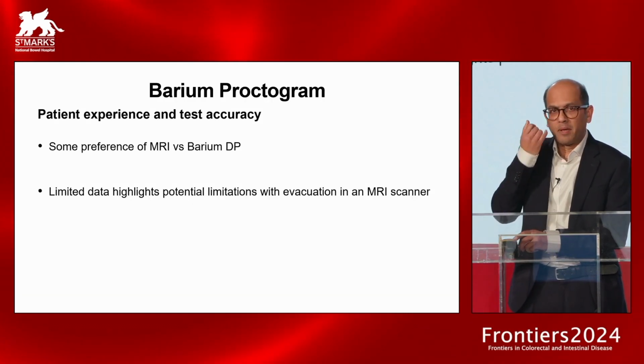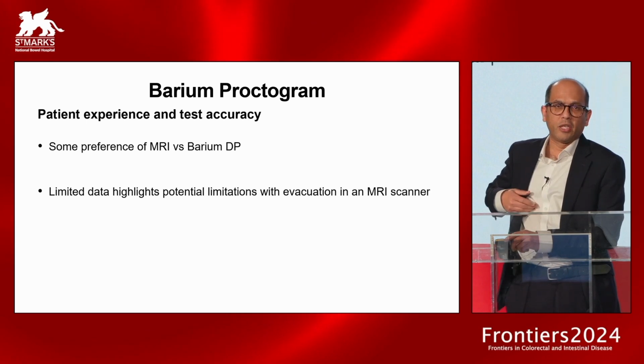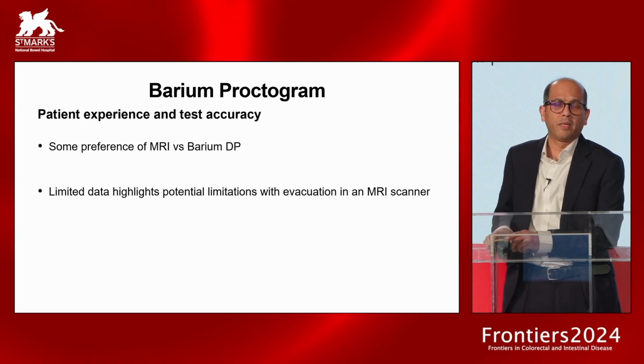So I'm just going to briefly talk about barium proctograms and the experience now. That last study did suggest that more patients preferred the MR, but I think there is still this question, and I think we need to look at individual patients' preferences.